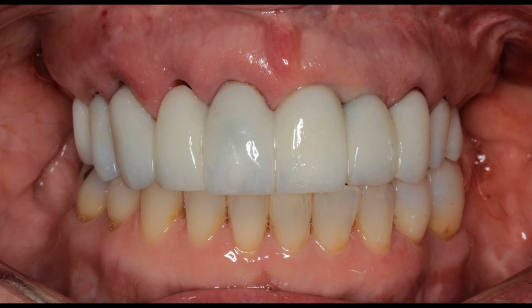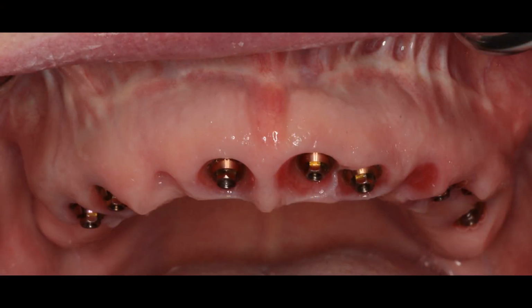She goes home and heals, comes back, and words almost escape me. This is so beautiful. The tissues have developed beautifully. The bone was nice and thick to start with, but she had all that bone loss around several of her teeth, and we still had a result like this.